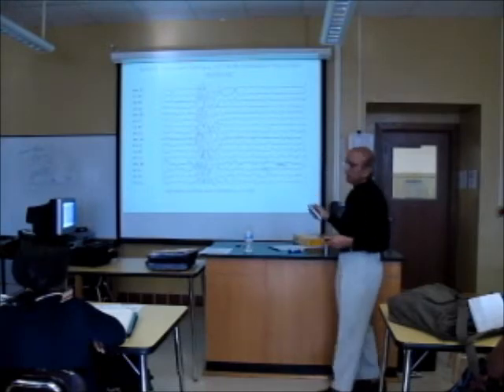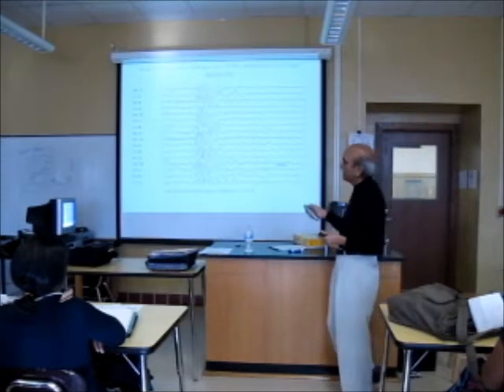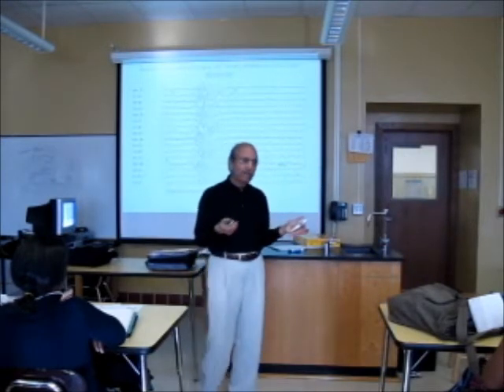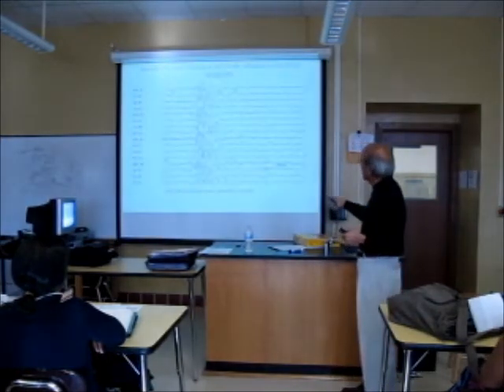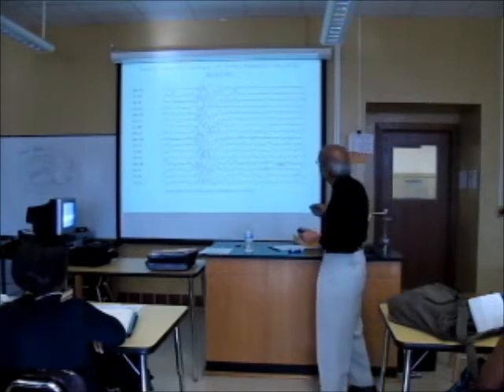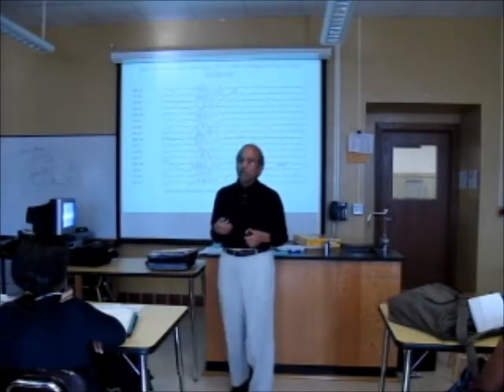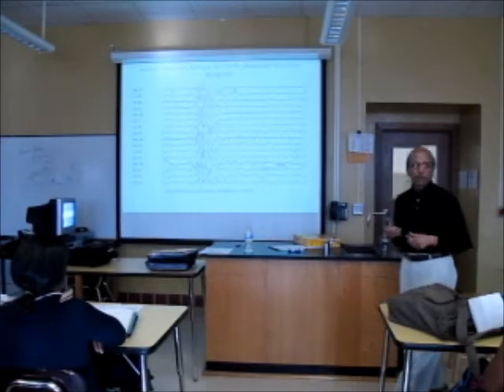In myoclonic epilepsy, one kind of myoclonic epilepsy is called juvenile, starting around the age of 6, 7, 8, 9, 10, 11, 12 years of age. And they have another very classical EEG abnormality all over the brain. There are faster spikes, more than 3 hertz, 4, 4.5 hertz, 5.5 hertz activity all over the brain. Okay?